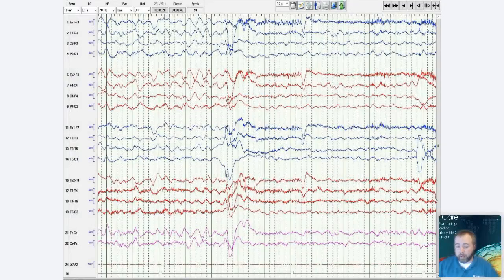So this is an epoch of a background on an 8-year-old boy. His amplitude is around 115 microvolts. The period to the right, then, there's a brief attenuation down to 25 to 30 microvolts. The very next page on this background jumps back up, and it's actually accompanied by a myoclonic jerk, which you can kind of see the artifact on the far right that is just starting there.